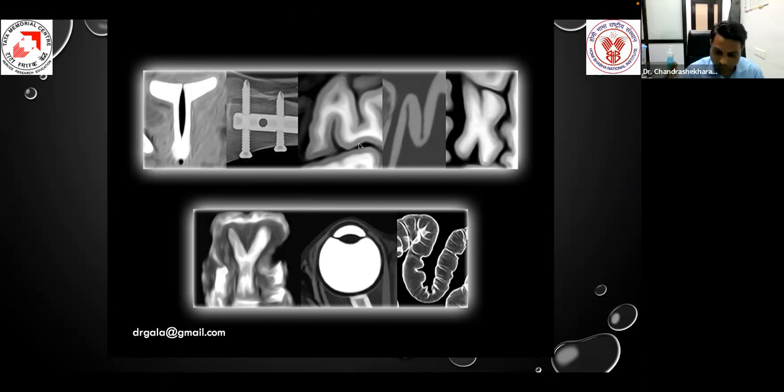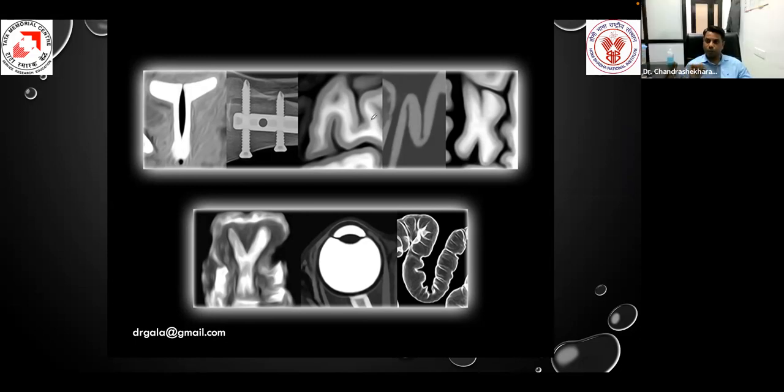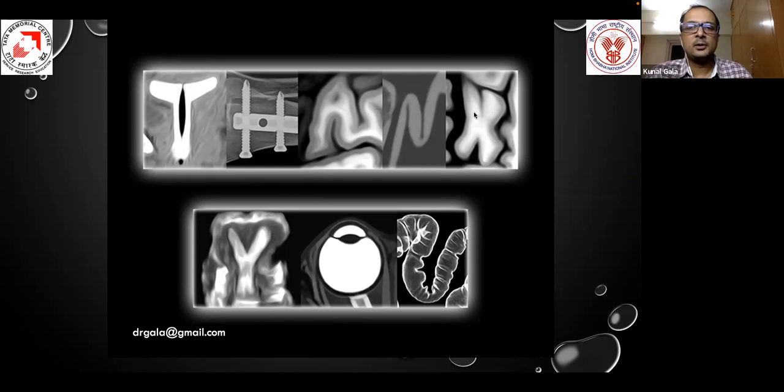And just a small comment to make. You showed one aortocaval lymph node which we have taken through the transpedicular approach. You can go through the transdiscal approach in that case. Yeah, going through the disc will be easier than going through the bone. So it depends on the location and the site from where we are doing it.